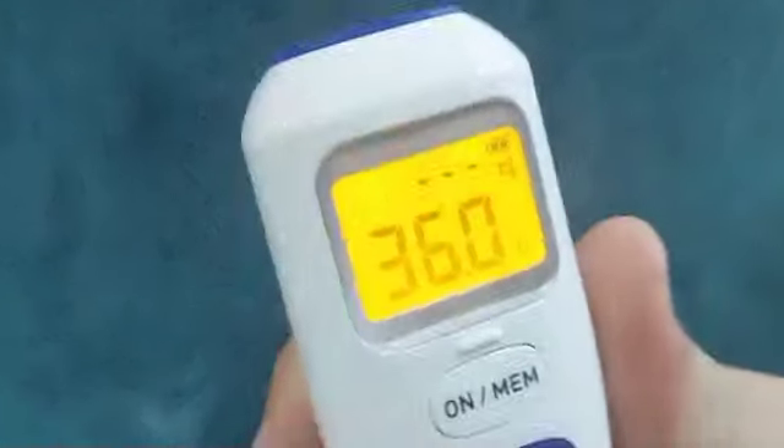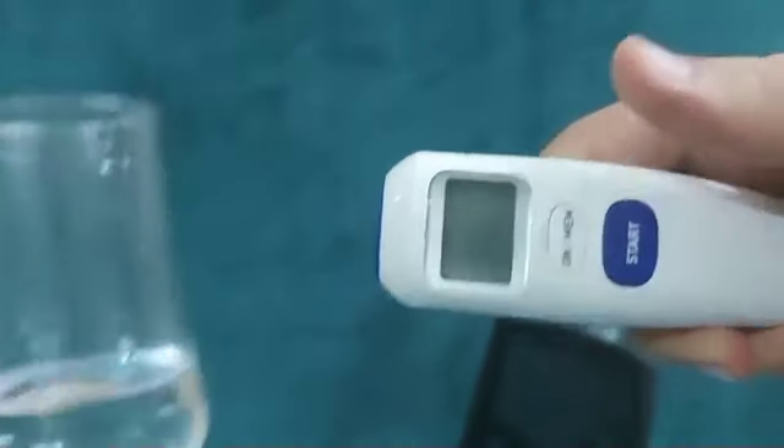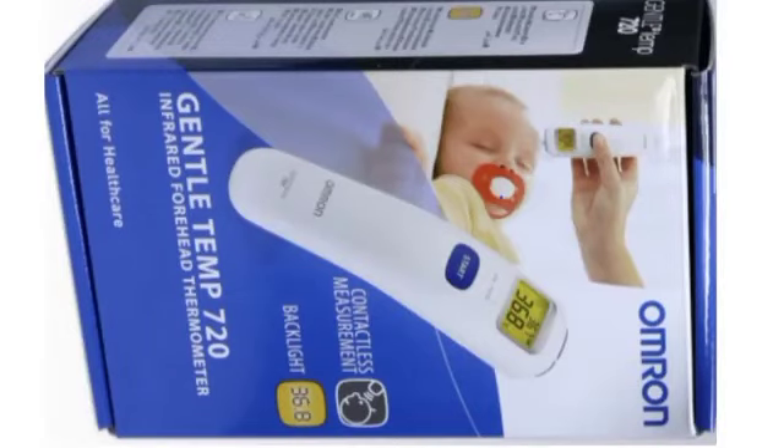The forehead temperature will be displayed in a second. If you want to check the temperature of a surface, such as a cold water glass, a cooking kettle, or a baby feeding bottle, this Omron thermometer has an excellent feature.